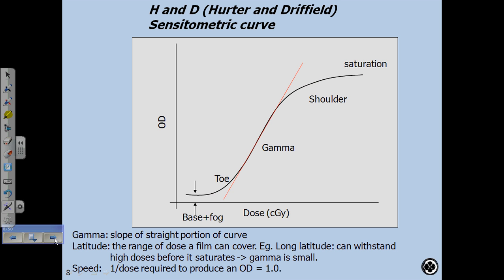What I do is I take a piece of film that I'm going to use, where I want to characterize it, and I cut it up into little squares. Then I write on each square how much dose I'm going to give to that square. So I have 10 cGy, 30 cGy, 50 cGy, through a range of doses that are going to be clinically relevant to me, maybe all the way up to 1,000 cGy. So I have little squares that I've labeled. And then I go into the linac room and I place a piece of film on some buildup, and then I set a 10 by 10 field, and I can place it at Dmax, and then I know if I deliver 100 monitor units that the film's going to get 100 cGy. So I put it in a known configuration.